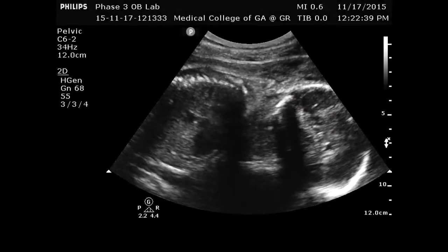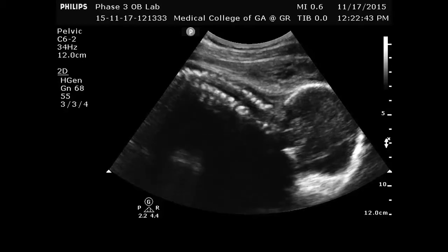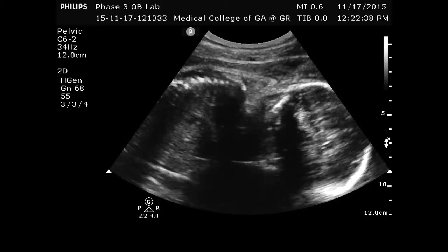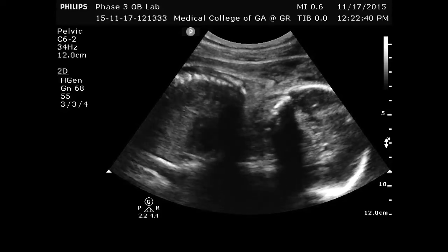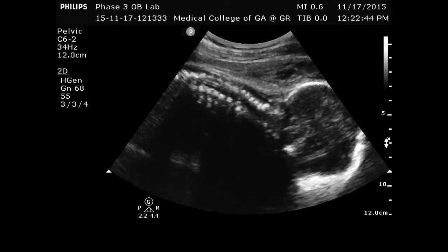Here is an ultrasound clip showing scanning to document fetal presentation. Notice that the cervical spine is seen at the base of the skull, which clearly demonstrates that the fetal head is towards the inferior portion of the mom, which is called the vertex position.